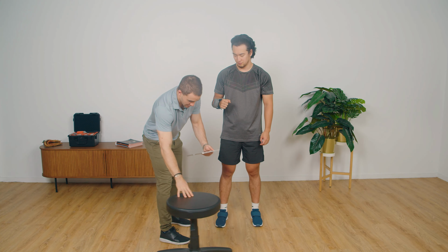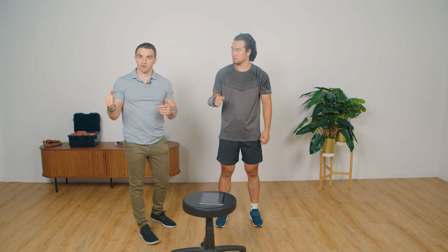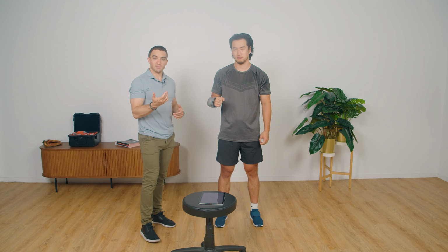So what I'm going to do is give Cal a bit of feedback on how much force he's applying, and I'm just going to use my hand to block. So I'm going to pop the dial down here and let Cal watch. Let's say Cal's been given a 5 kilo restriction in external rotation. What I can do is use the dynamometer to give him feedback of what that feels like.